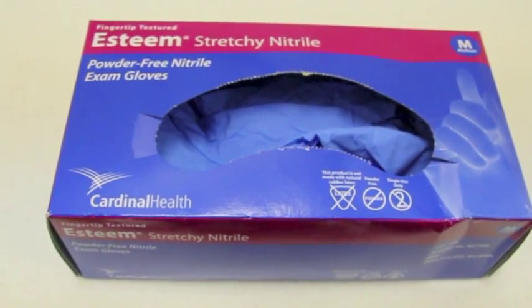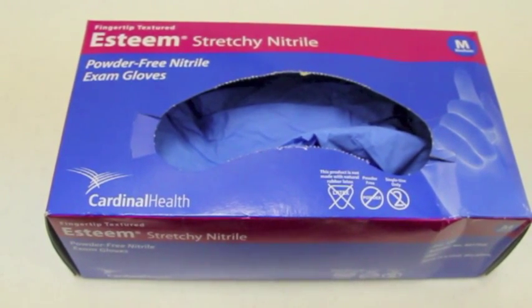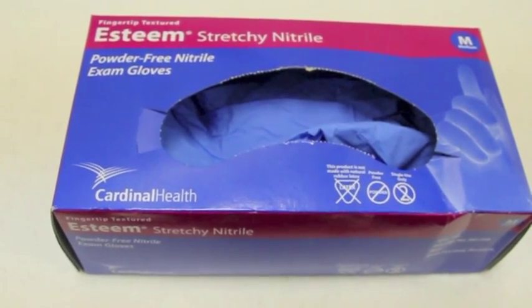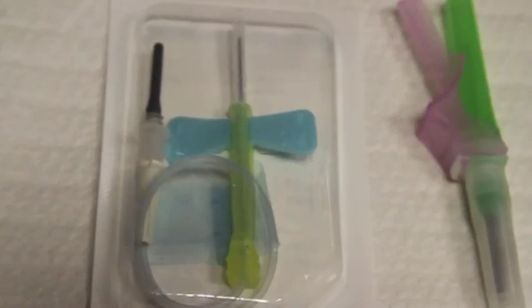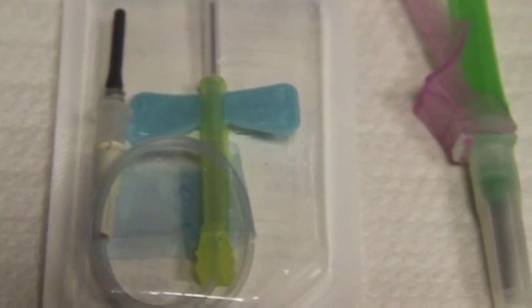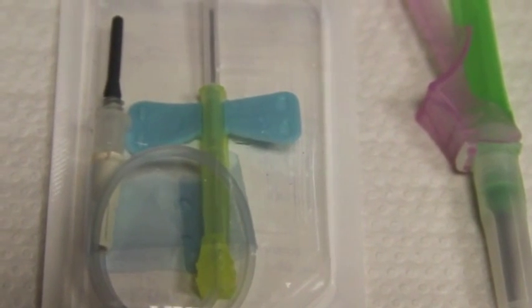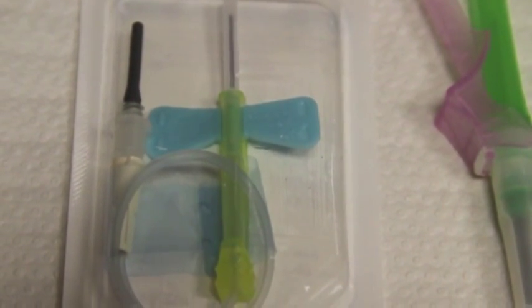Latex-free gloves form a part of the personal protective equipment that is required to be used. The gloves need to be free of latex, as this substance can cause allergic reactions. Safety engineered single-use needles are used for the protection of both the patient and phlebotomist. The safety needles help to prevent potentially dangerous needle stick injuries.